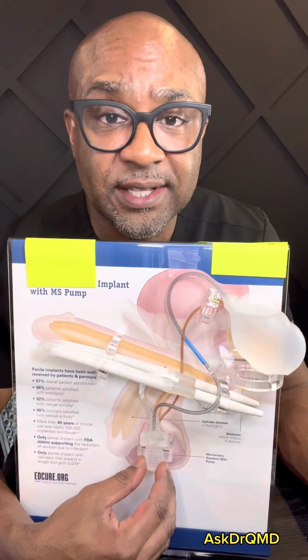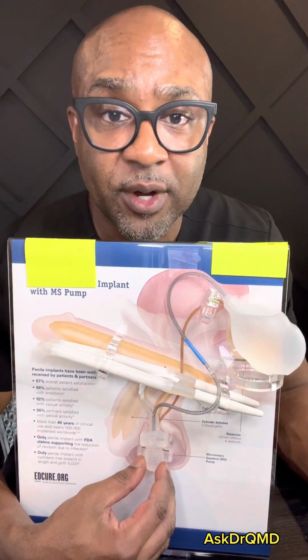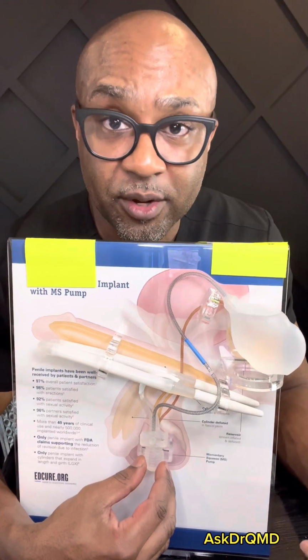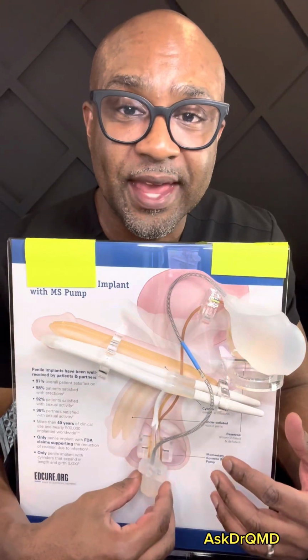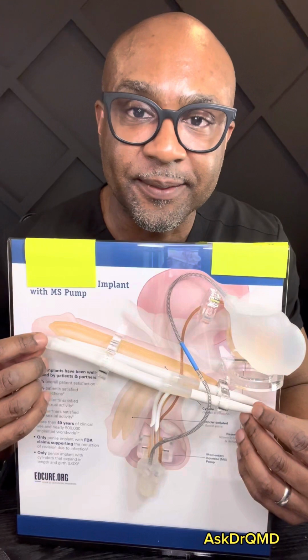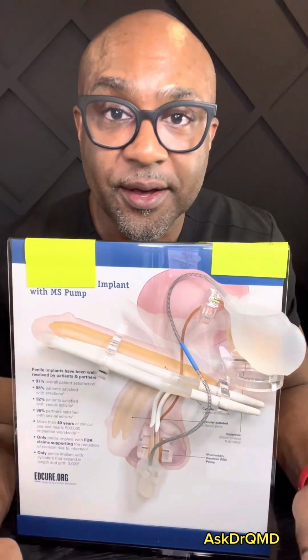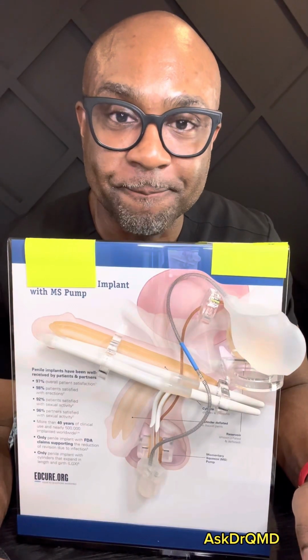Well, obviously, because it's mechanical, you can have mechanical failure of one or all components. You can also have erosion of the prosthetic. I had a patient who had some mental challenges and he left his prosthetic up all the time, and so it eventually eroded through the end of his penis. And so that was not a good look for him.